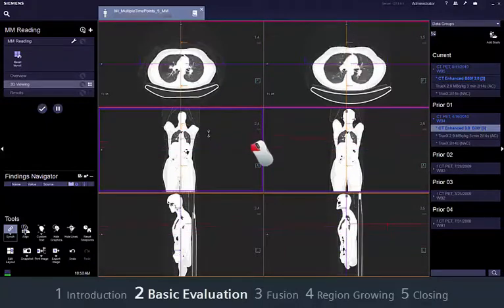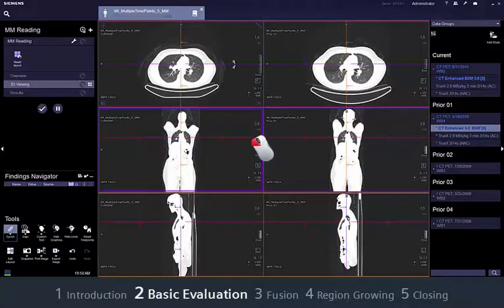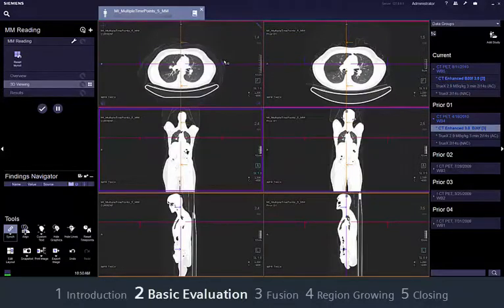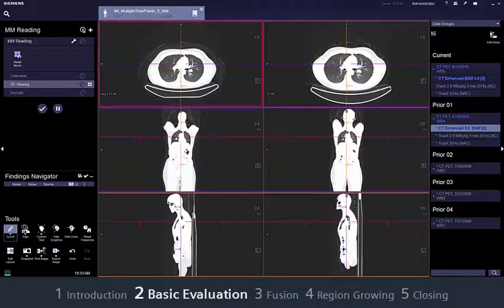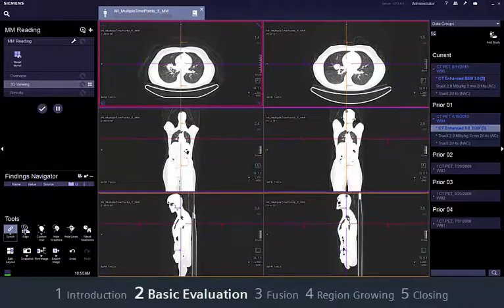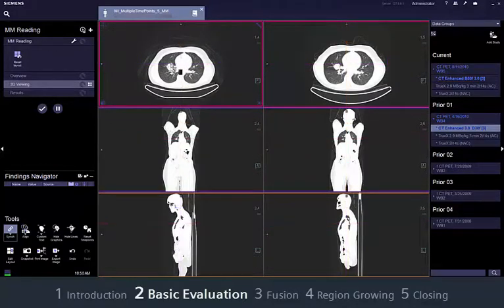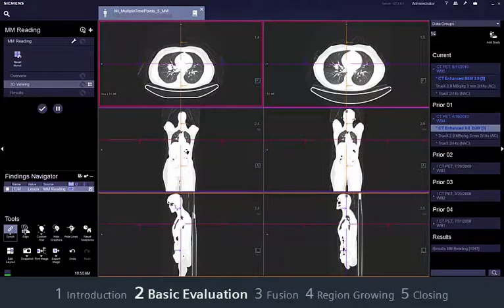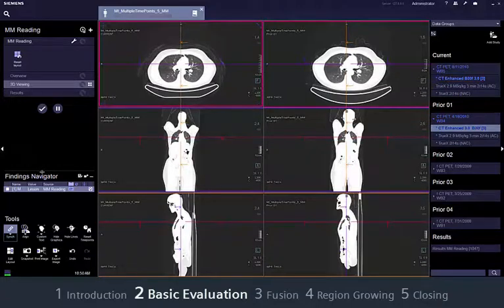While scrolling through the slices, use the measurement tools, for example to mark suspicious structures, so you can easily find them again later by clicking on the finding in the findings navigator. Click on the finding to show the suspicious lesion in all segments.